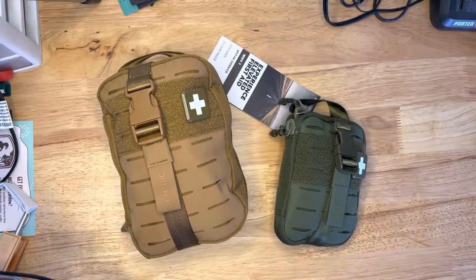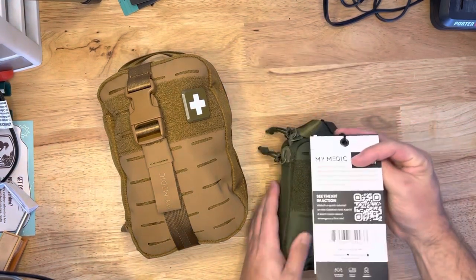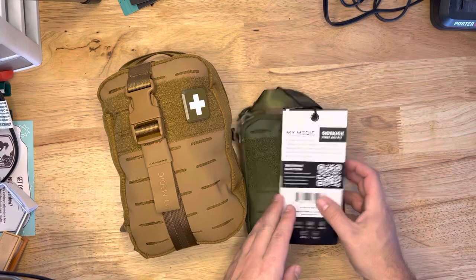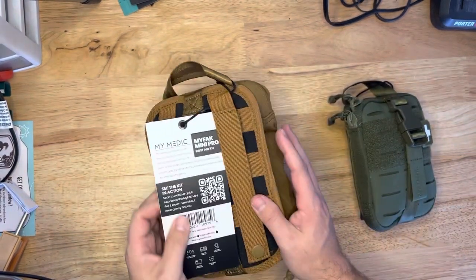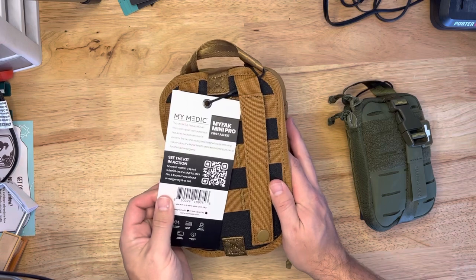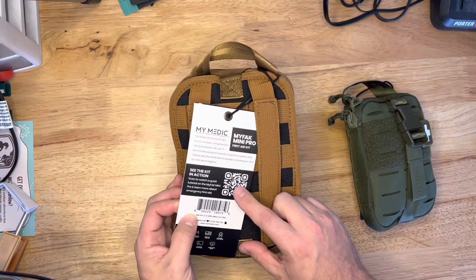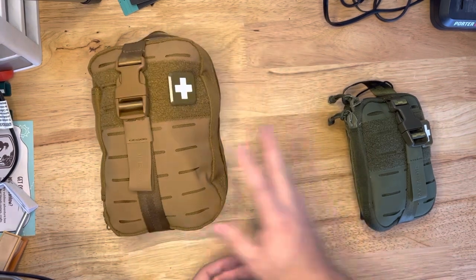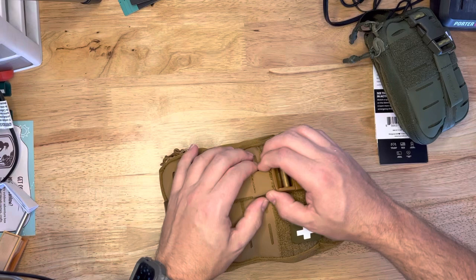Big one and small one. So what do we got going on here? This is the MyMedic Sidekick, and this guy is the MyMedic MyFAK Mini Pro. Cool QR code if you want to see it in action — there's a video on that. We'll take a look and see what's inside of these in a sec. Kind of a bigger one, let's go ahead and start there, the big guy.